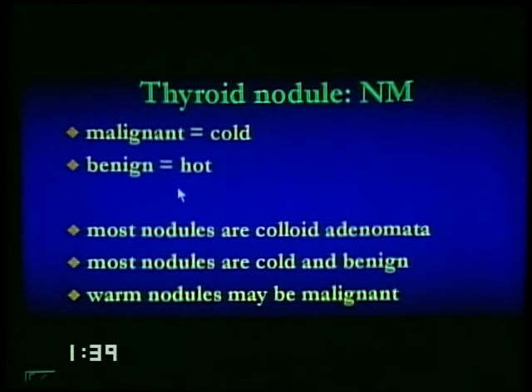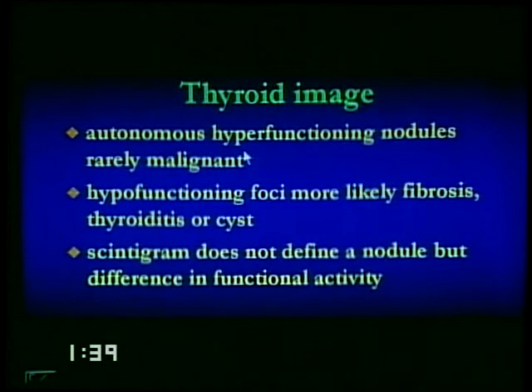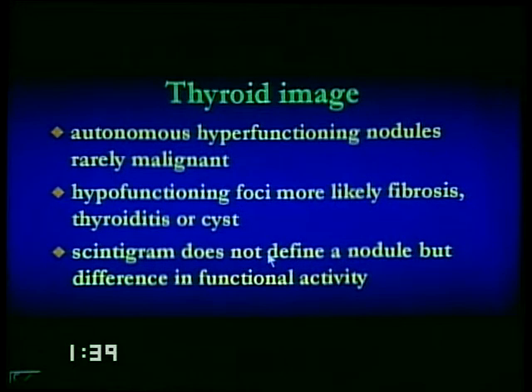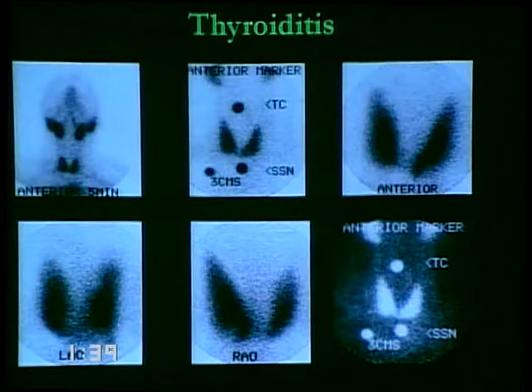For most practical purposes, almost all of your tumors are going to be photopenic, or not going to be able to organify orally ingested radioiodine. If you have a nodule, you're not really looking for the tumor, because a nodule that does not take up could either be malignant or it could be replaced by some kind of storage disorder or burnt out thyroiditis, both of which are much more common than cancer. You're doing it to define increased activity. It's not the other way around. So you're trying to find hyperfunctioning areas or a hyperfunctioning background parenchyma.